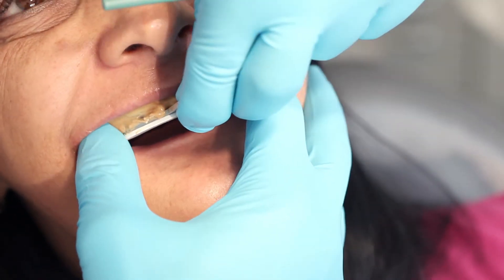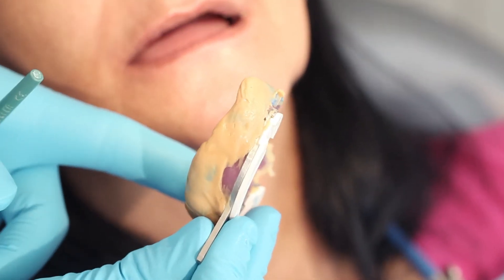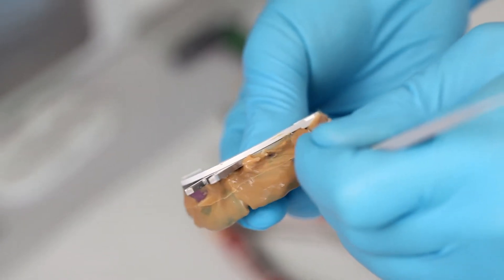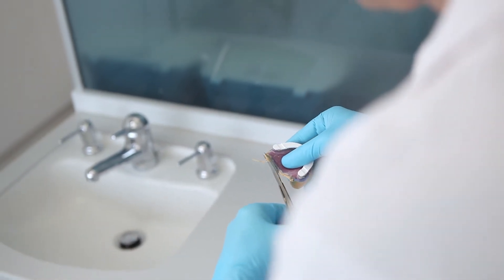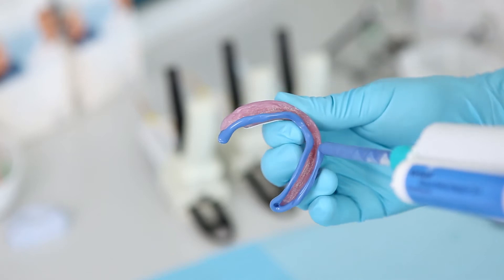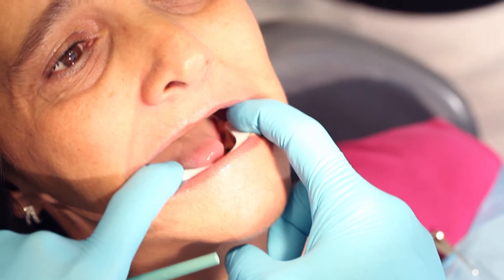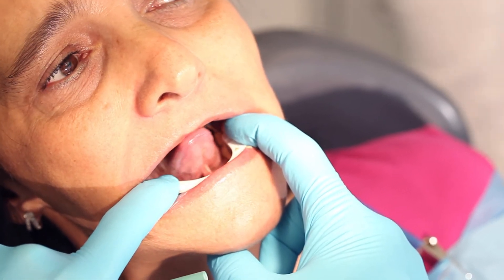All the important anatomical details should be visible without any voids. Excess material must be removed, particularly in the area of the tuberosities. The functional impression of the lower jaw is taken in the same way as that of the upper jaw. The only difference is that instead of having the patient suck on a finger, she is asked to stick out her tongue and move it to the left and to the right a few times, touching the upper lip.